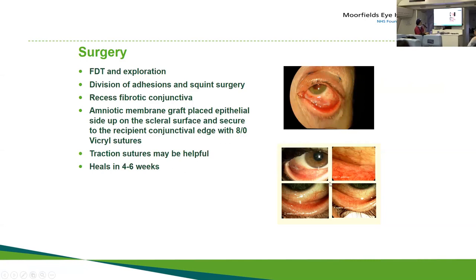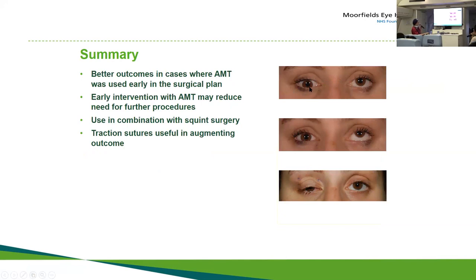We explore, divide up the adhesions, do the squint surgery, separate the scar tissue, then insert the amniotic membrane and stitch it into place. We often use traction stitches to hold the eye in position away from the scarring. This is one patient immediately after, at day seven, two weeks, and four weeks — it all goes away and you're not left with a permanently scarred piece of tissue in the eye.